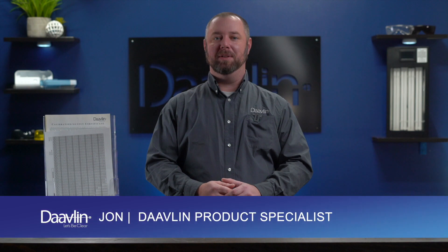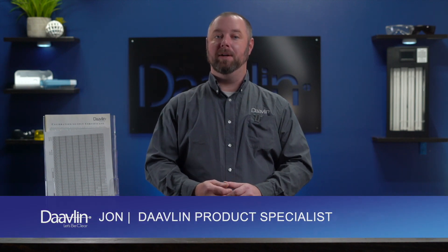Hi everyone, John here from Davlin. If you're watching this video, you've received your Davlin home phototherapy device and you're on your way to Living Clear. In this video, we'll show you how to use your doctor's treatment plan to get started with your home phototherapy.